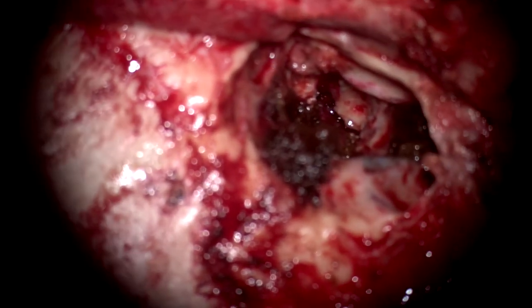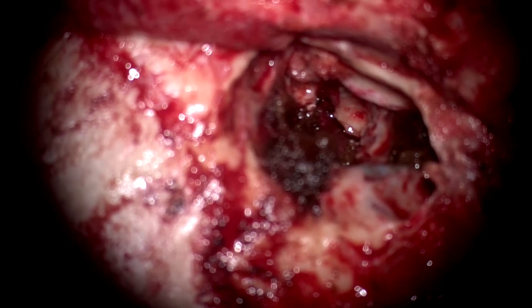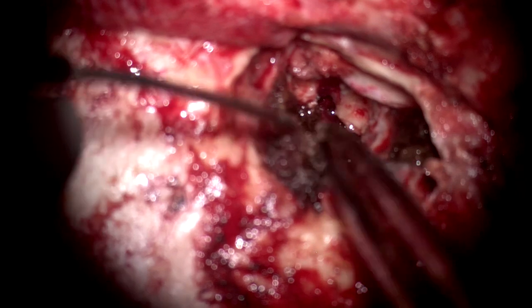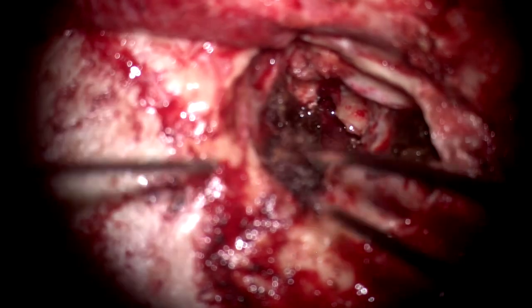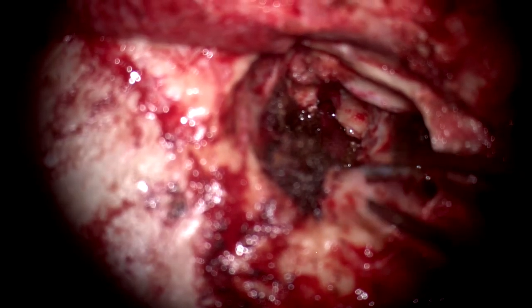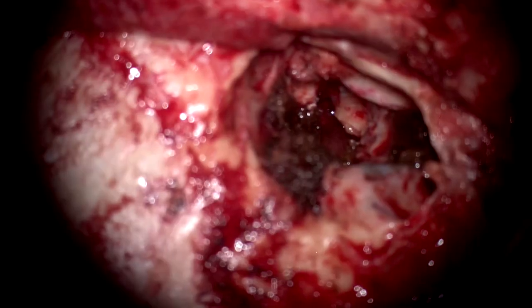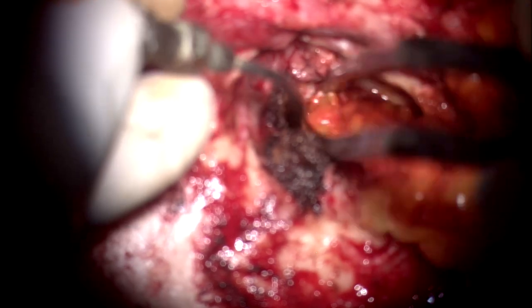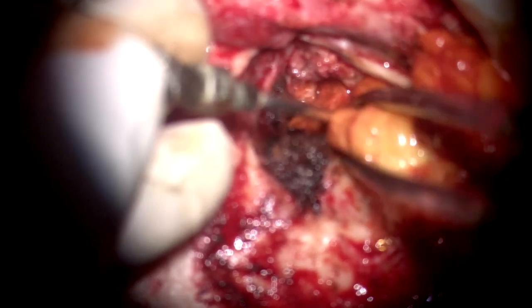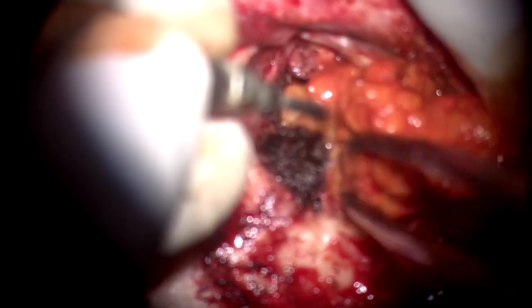Yes, now, long pieces of fat, long pieces. Thin and long. I will block this entire tunnel with the fat. So yesterday you taught us about the vascularized flaps present around the ear. Yes. So why not use those in place of fat? This is a bony tunnel. See, this is a bony tunnel. This is not a lining or an obliteration in a soft tissue space. This is a bony tunnel. See this? Even this one is sufficient.